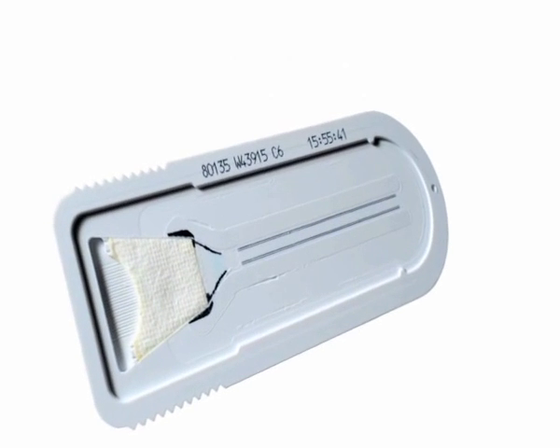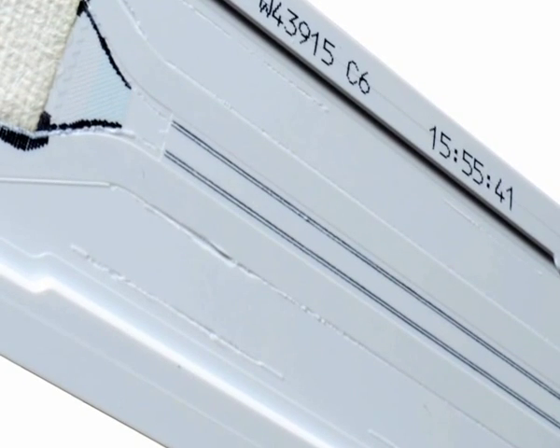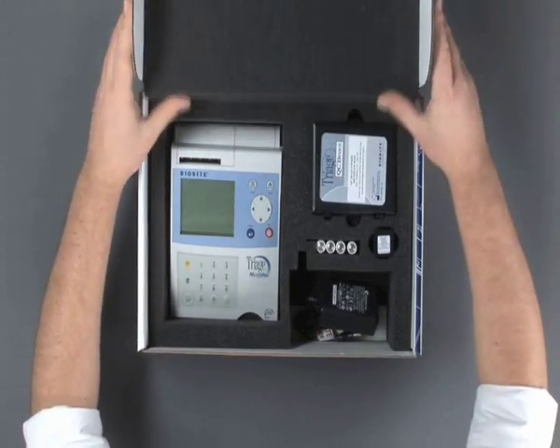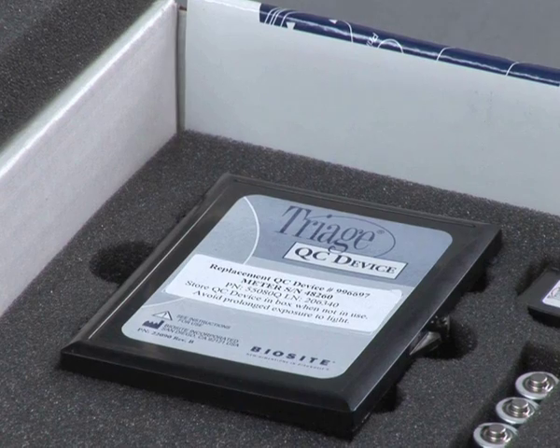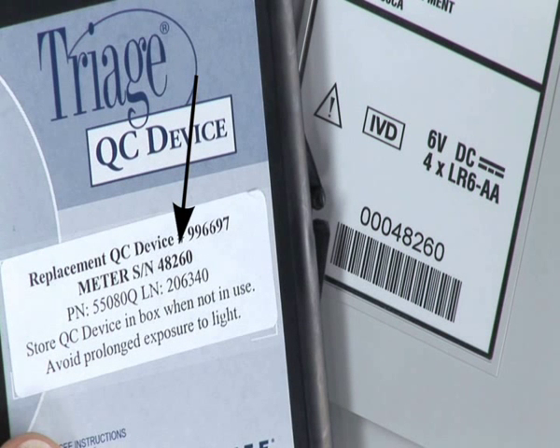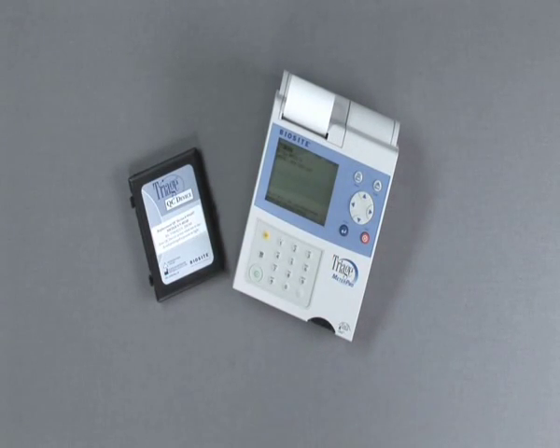Triage MeterPro QC. As discussed earlier, the Triage devices have built-in controls on every device that are performed each and every time you run a patient sample. In addition to the internal controls, you will need to perform the QC device to verify the performance of your meter. Each meter you receive from Inverness Medical will have its own QC device. Before you begin testing, make sure the serial number on the QC device box matches the serial number on the Triage meter. It is recommended that the QC device is run every day of patient testing.